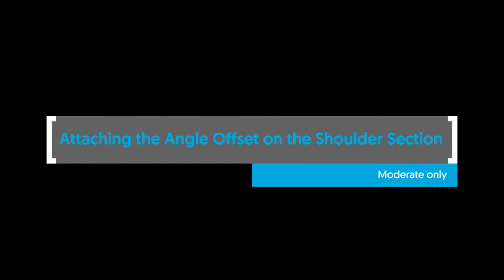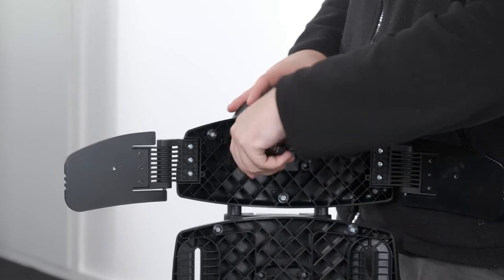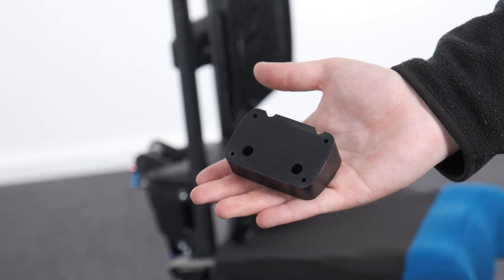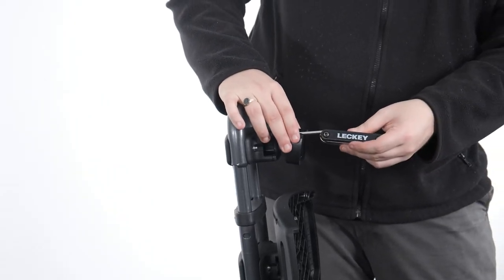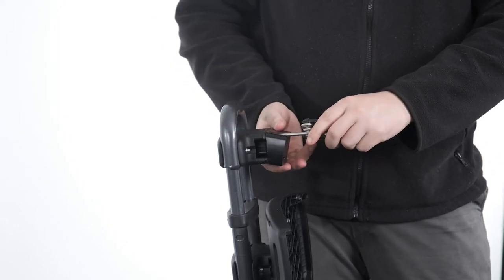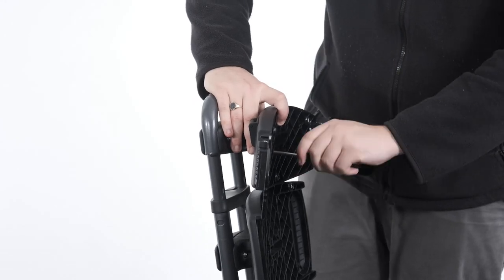Attaching the angle offset on the shoulder section — moderate backrest only. To attach the angled shoulder spacer, remove the four screws to separate the moulding from the clamp. Place the back plate spacer onto the front surface of the clamp moulding. Secure the angled shoulder spacer using the four longer screws. Reattach the shoulder moulding by tightening the screws into the angled shoulder spacer.